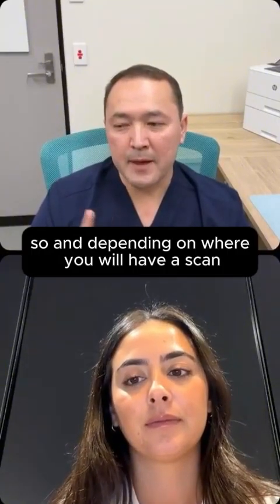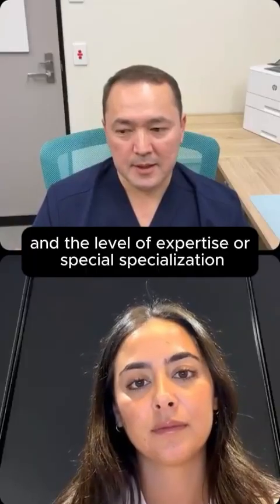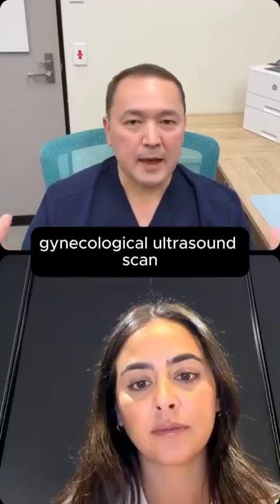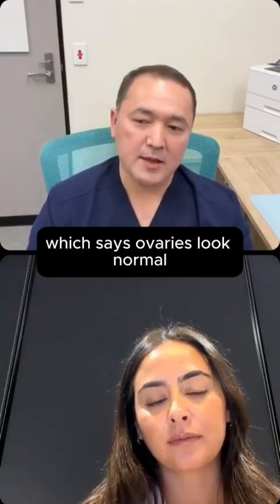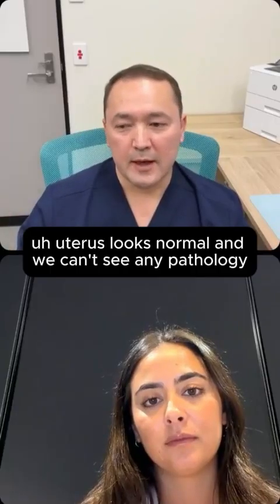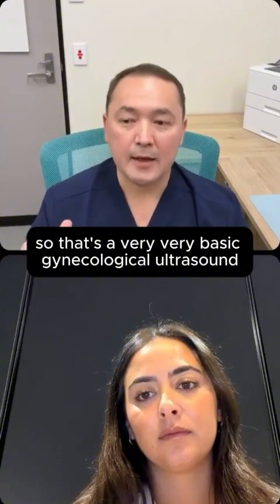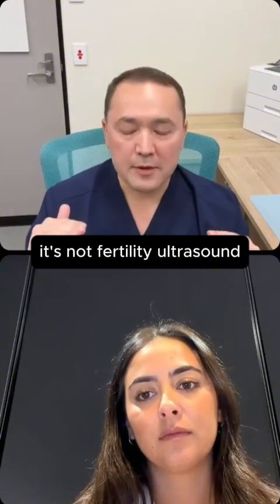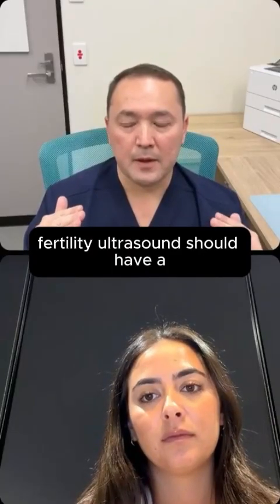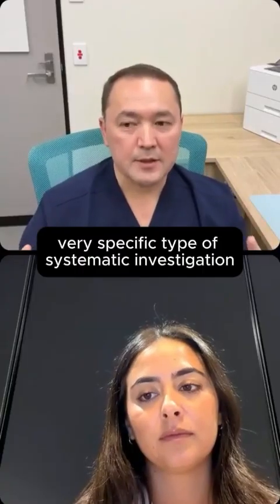Depending on where you have the scan and the level of expertise or specialization, you may just end up having a simple gynecological ultrasound scan, which says ovaries look normal, uterus looks normal, we can't see any pathology. That's a very basic gynecological ultrasound. It's not a fertility ultrasound. A fertility ultrasound should have a very specific type of systematic investigation.